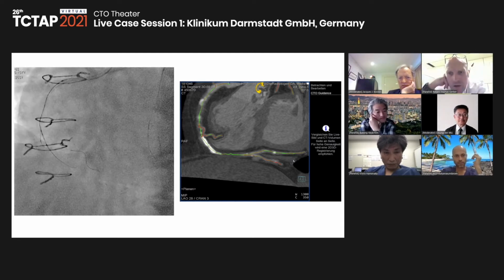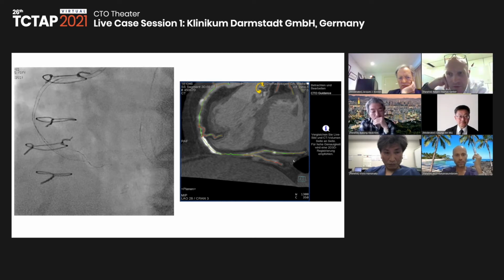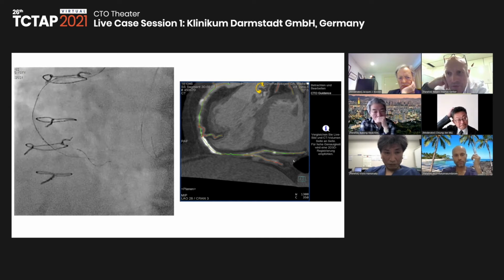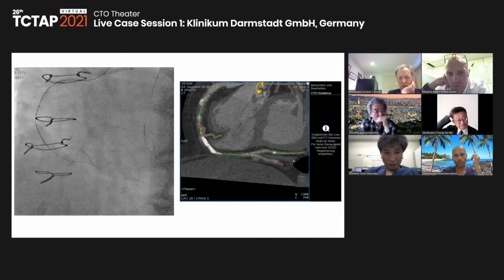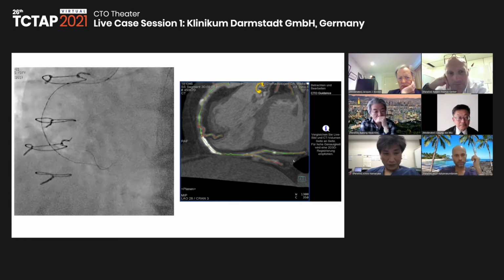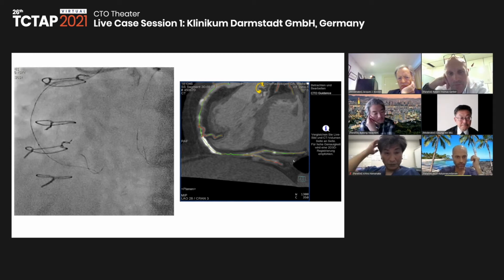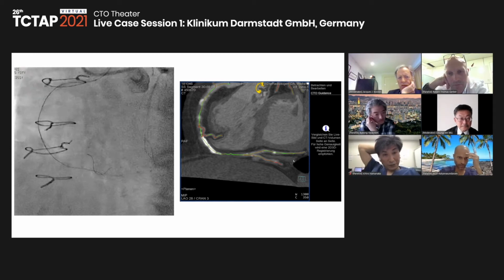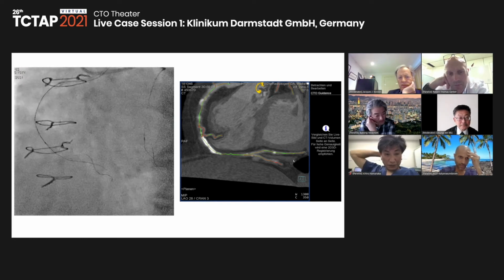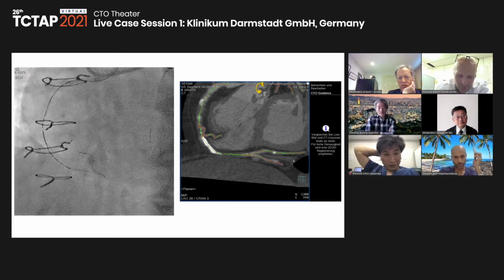I mean, why not just wire escalate here now? Looking at that, take a Gaia 3rd, because you're going to need a bit more push. Yeah, but I don't need it because I make progress, as you see. Oh yeah, I've just seen now. I'm not sure where it does go. Right, but it doesn't move as freely as it used to. It's a little bit maybe better, and it's also more difficult, but I can advance the Fine Cross.